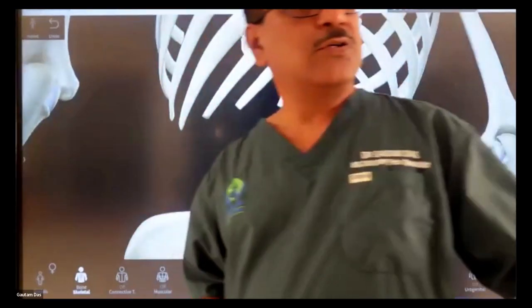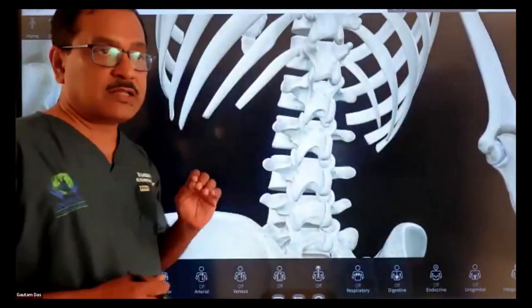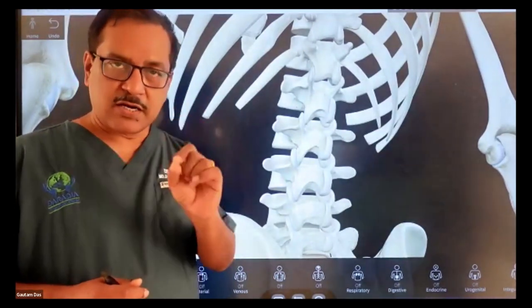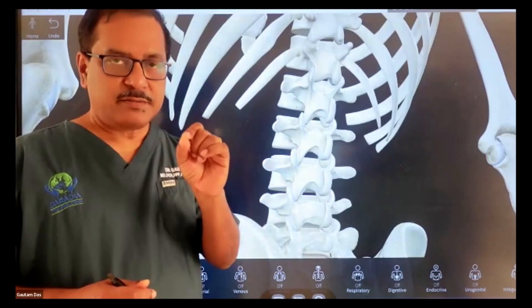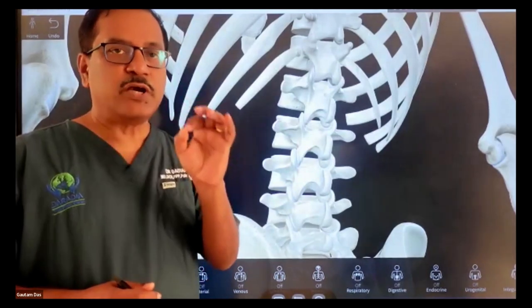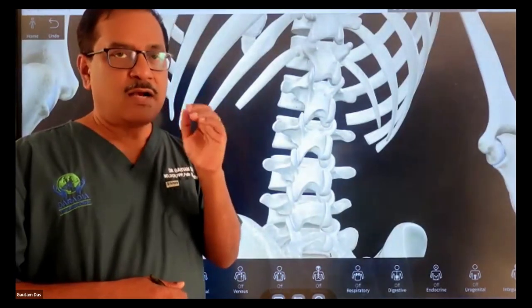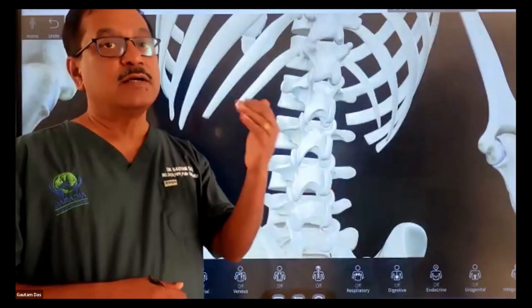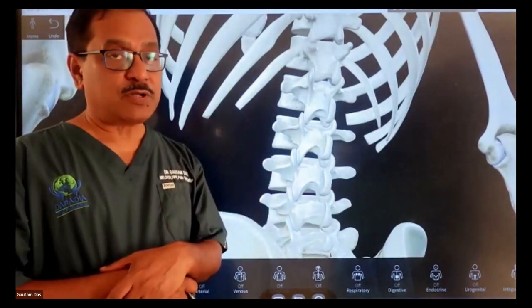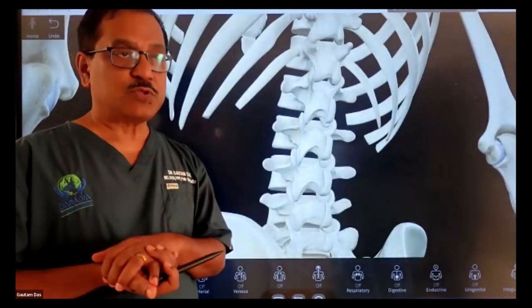Okay. So today we'll be going with the lumbosacral procedures. In these procedures, we'll be discussing the facet joint, intra-articular and medial branch, because nowadays the medial branch block is more important, as we can get long-term results with radiofrequency of the medial branch. Then we'll go for the transforaminal and lumbar sympathetic, sacral nerve block, caudal epidural and sacroiliac joint injections. So these are the 6 procedures which we'll be demonstrating.